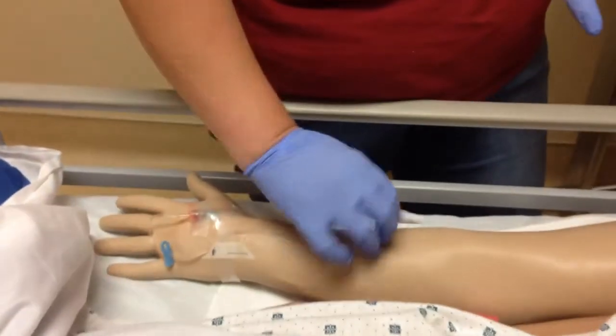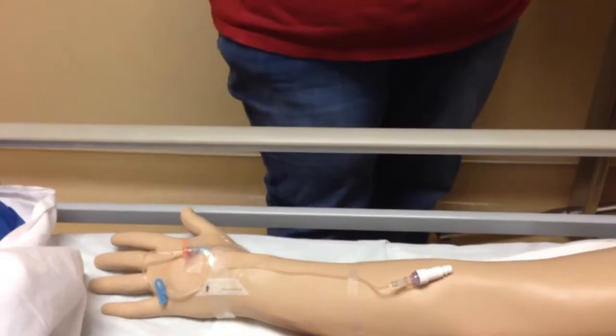Now, when you're giving an IV push medication, just like with Mr. Dunn's IV, he has a saline lock. He doesn't have fluids going to it. It's just saline locked. Now, we always have to verify the patency of our IV to make sure that it's not going to infiltrate, because we would want to make sure it's patent before we put in a medication that might be irritating to the tissue. So we need to make sure it's patent.